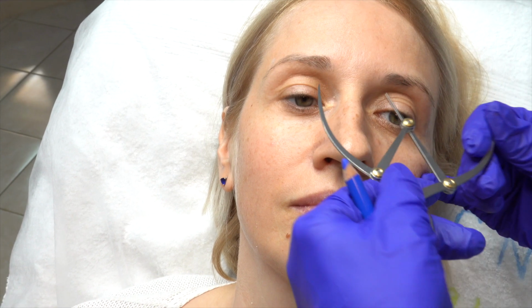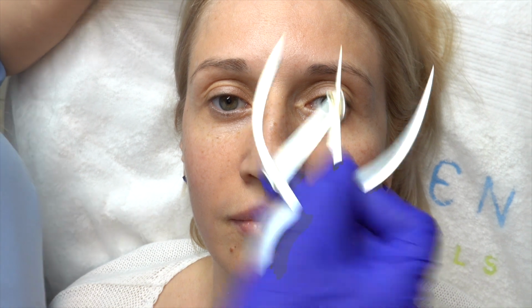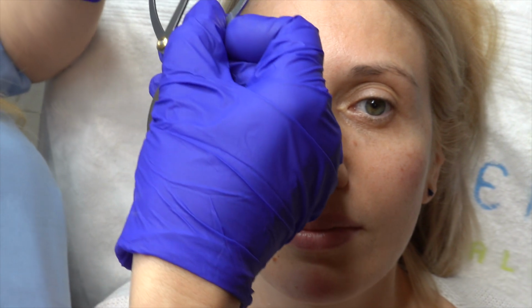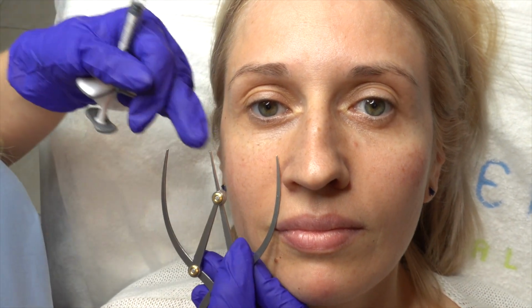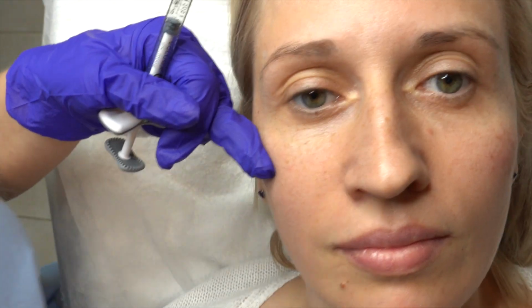And now I want to double check the apex of the cheeks. Again, measure the distance between the eyes, flip calipers and go to the apex. Can you see? It's right here where it should be. Now I will do the same for the second side. First measure again the distance between the eyes, and then go here to the apex of the cheeks on the alar tragus line. It should be here.